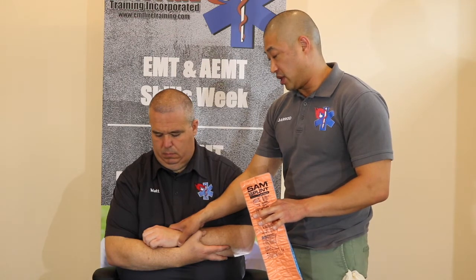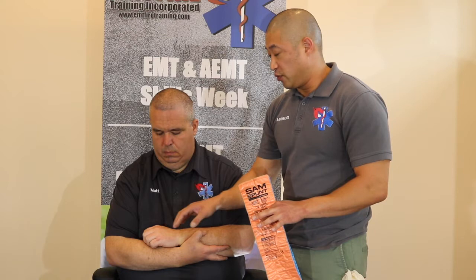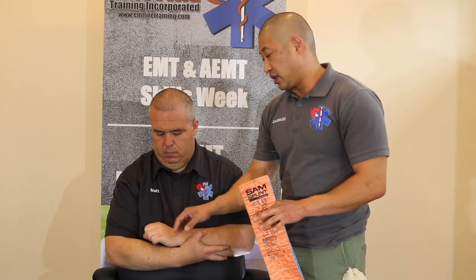Before we apply the splint, we also need to assess his CSM — circulation, sensation, and motor function. When checking circulation, we check for a pulse distal from the injured part of the extremity — he does have a good radial pulse. We also check motor: can you move your fingers? And sensation: can you feel me touching your fingers? Any numbness or tingling? No — wonderful.